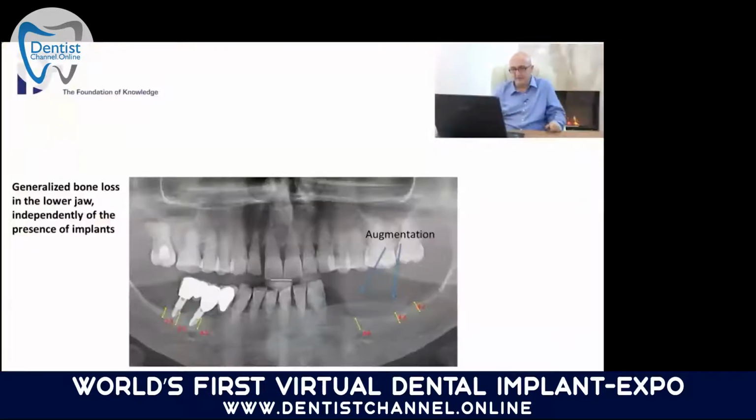What I'm teaching you, or what I'm making you aware of, is that to solve such a case would take us exactly 3 days. And we are not waiting for the bone to heal or the osseointegration to take place. We are actually waiting for the dental technician to give us the bridge. And unfortunately, 3 days is typically the time that they need, and 3 days is also the time until the osteonal remodeling starts.